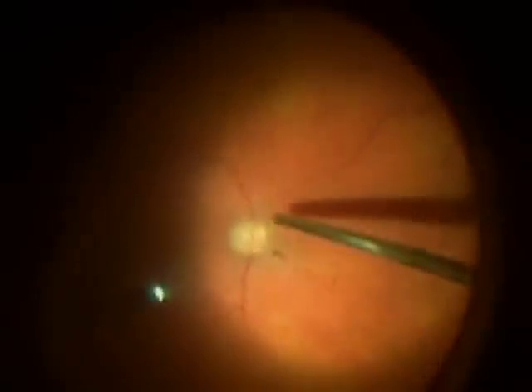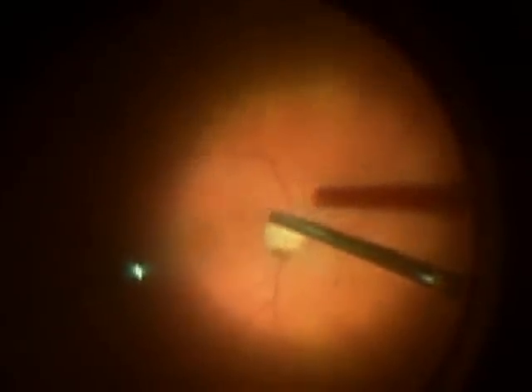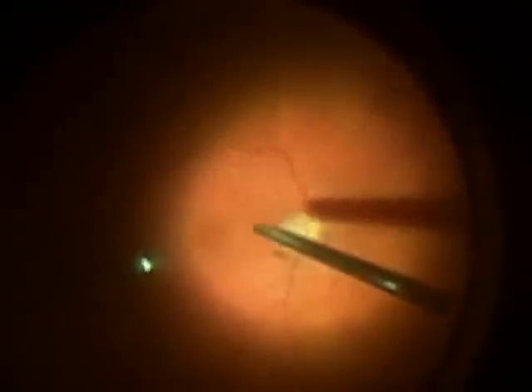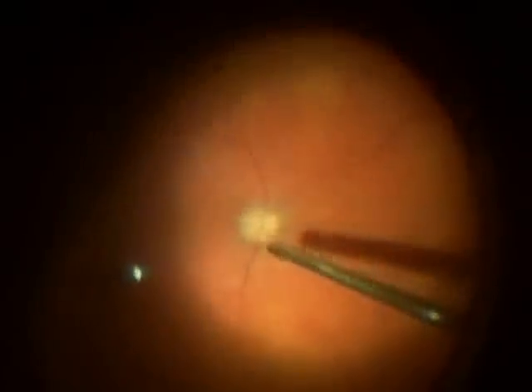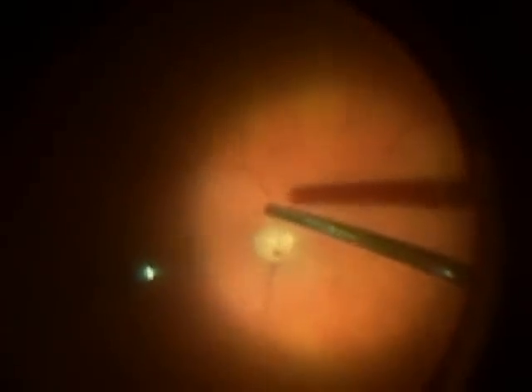There's a layer of vitreous which is tightly adherent to the posterior surface of the eye, and that's the layer responsible for causing the macular hole to open. It takes some time for the vitreous to be pulled free — first of the optic nerve, which is the white circle in the middle of the picture — and then you'll see the macular hole, which is slightly to the left of the optic nerve. The surgical video is sped up to two times normal and extensively edited. What you're seeing in a little less than seven minutes is about an hour-long surgical procedure. Here you see the vitreous being pulled more forward.